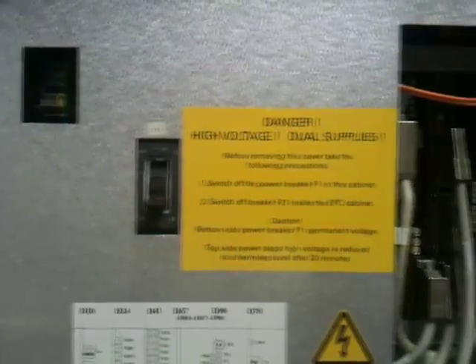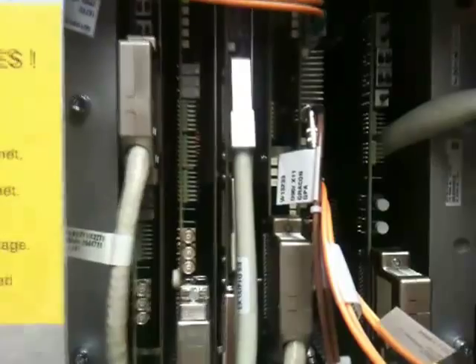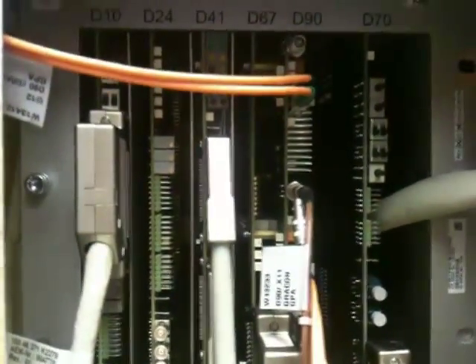There's a diverter valve used for diverting water through the heat exchanger. This is the control unit — loads of circuit boards in there, no idea what they do, looks incredibly complicated. This is all within the gradient cabinet, so presumably it's all related to signal processing.